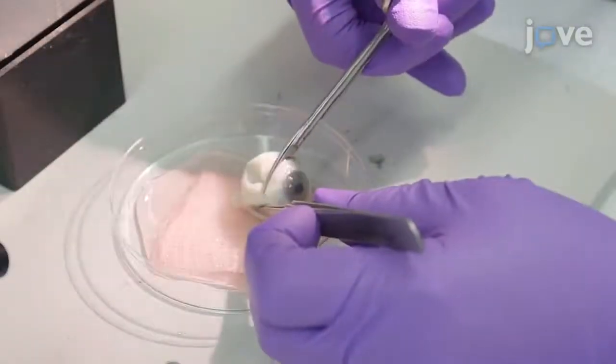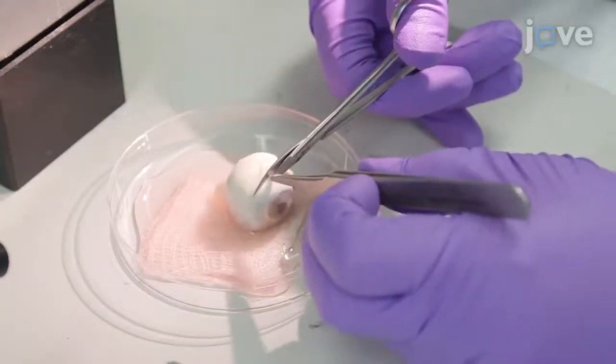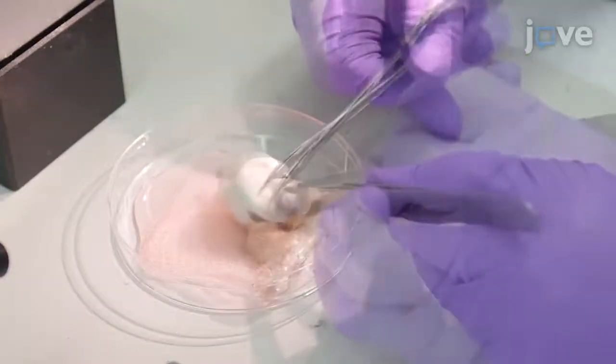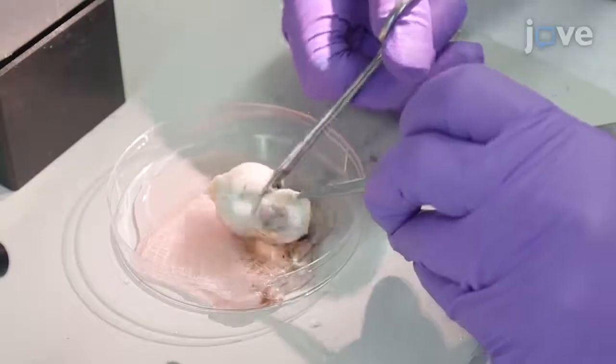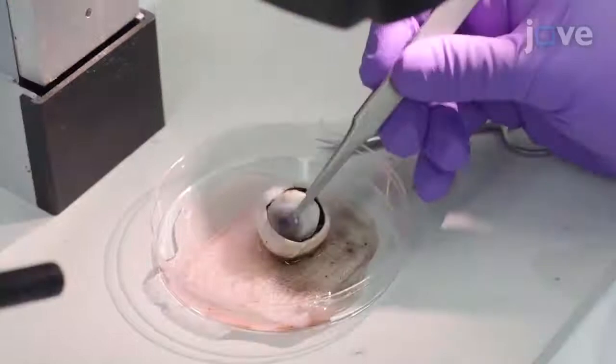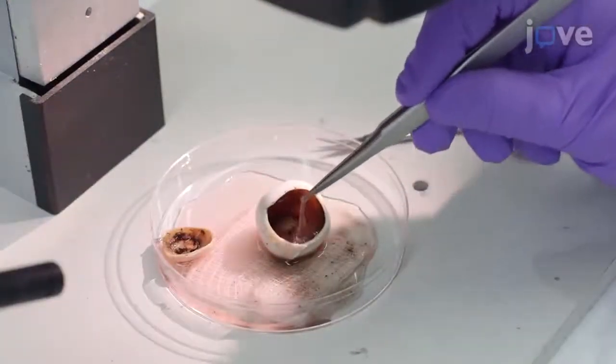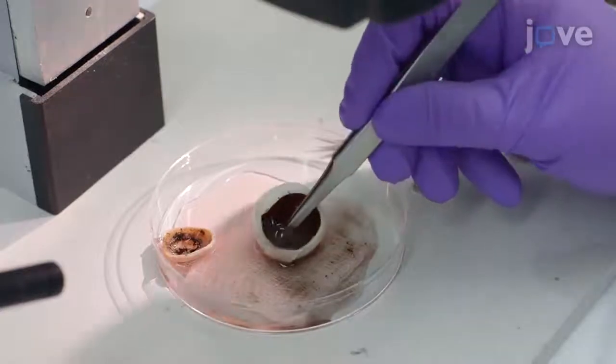Then use fine blade scissors to make a full thickness incision and circumferentially extend the incision in either direction around the eye. Then remove and discard the anterior segment, including the cornea, lens, and iris.